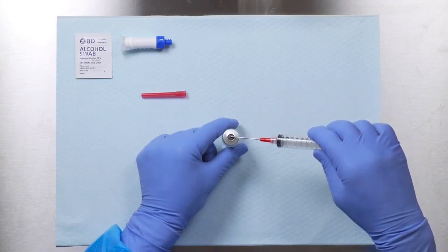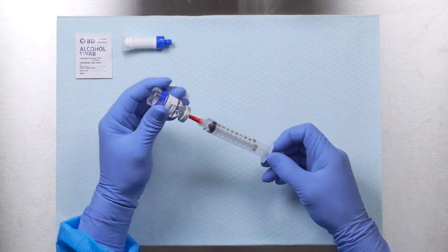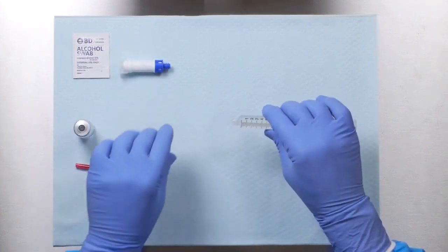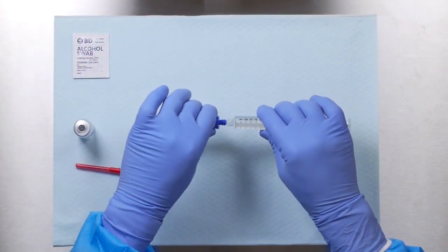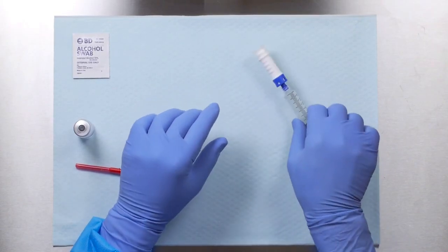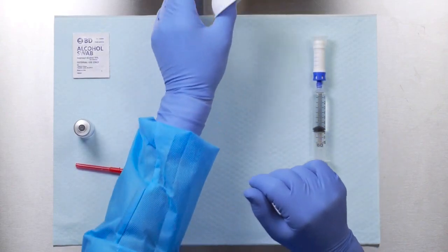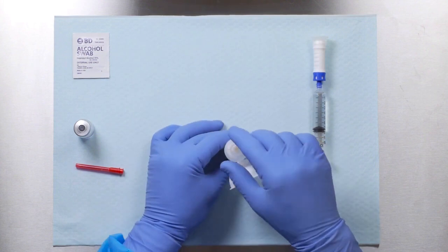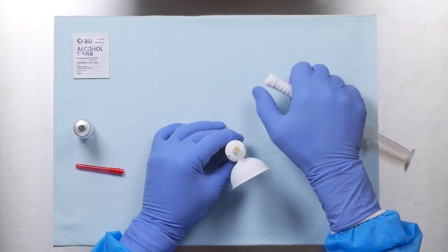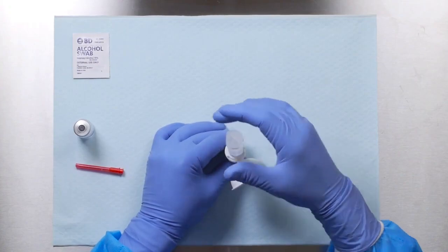Draw the required volume of diluent into the syringe. Hold the blue hub on the injector and connect to the syringe. Ensure all luer lock connections are securely tightened. Remove the cap from the protector connection interface. Remove the injector protection cap and slide the injector straight onto the connection interface until the two pieces snap together.